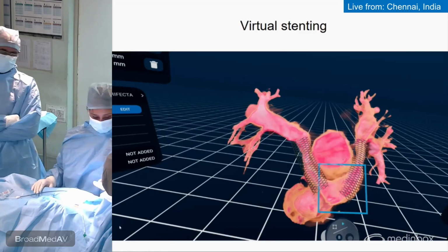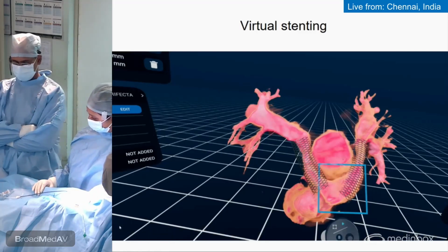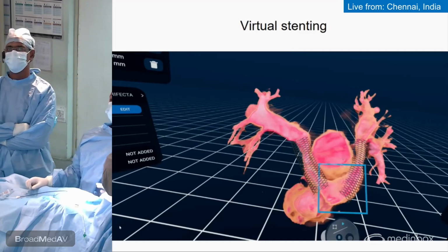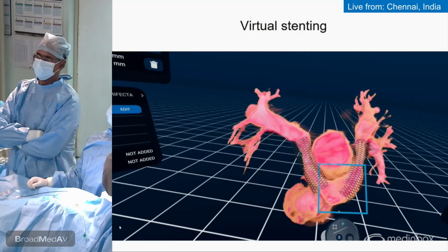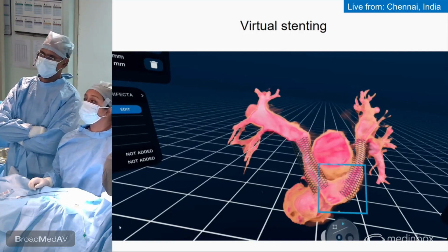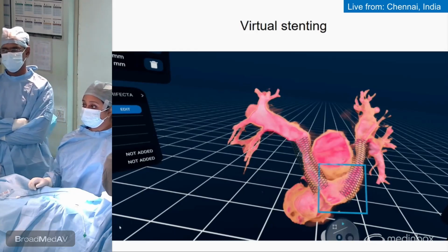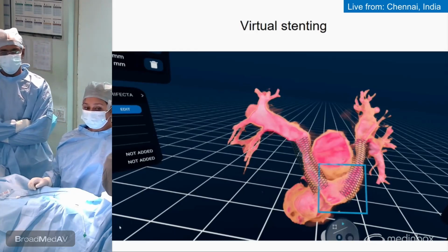Branch PA stenosis after this arterial switch operation is a common complication that is known and varies from studies, and it varies from 7 to 40%. And this is one of our patients who is presenting now with branch PA stenosis, who is having increased RV pressures. So we have taken him for an intervention.